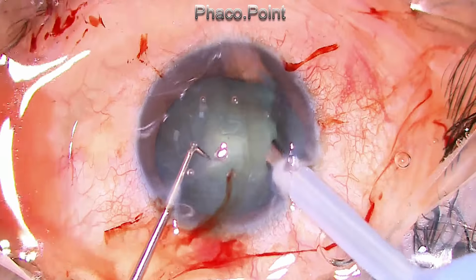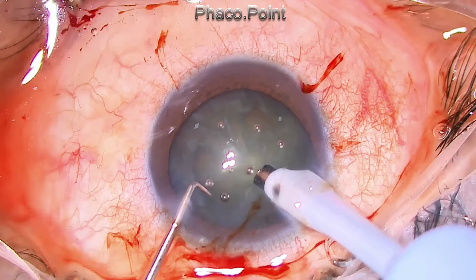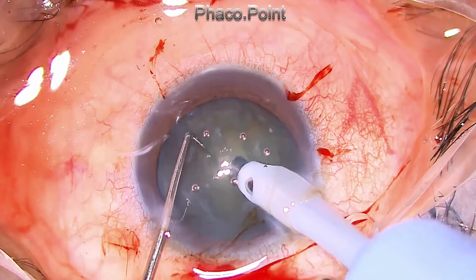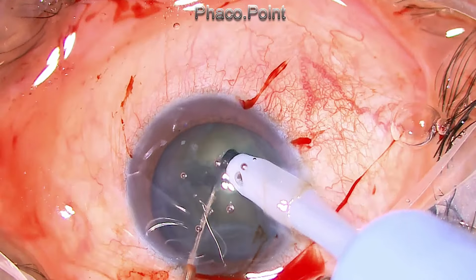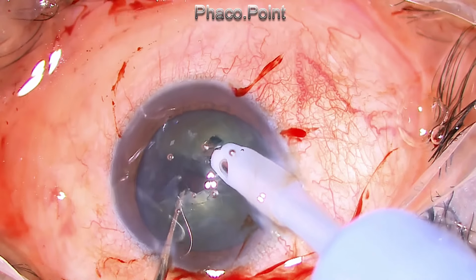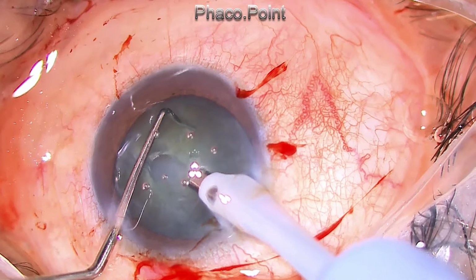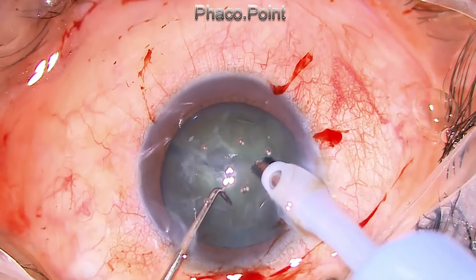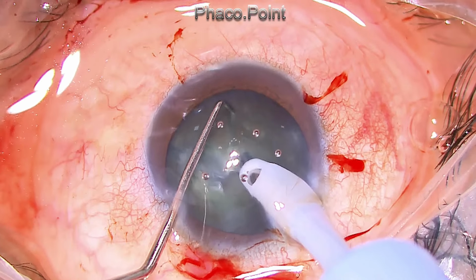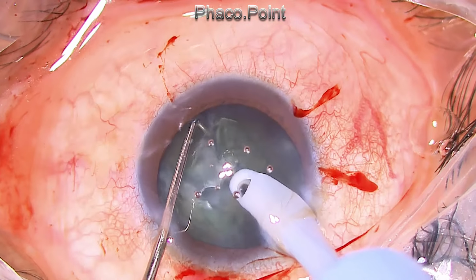I went ahead with phaco emulsification. I probably did not end up getting a good cortical cleavage hydrodissection in this patient, although I got the initial crack and separation and a through and through chop with my first attempt. I found that it was not possible for me to rotate the nucleus. Of course, rotating the nucleus should not be done too vigorously, because this can lead to further progression of the zonular dialysis. So if a gentle attempt at rotation does not work, don't attempt to rotate the nucleus.